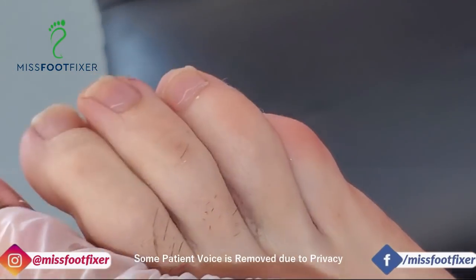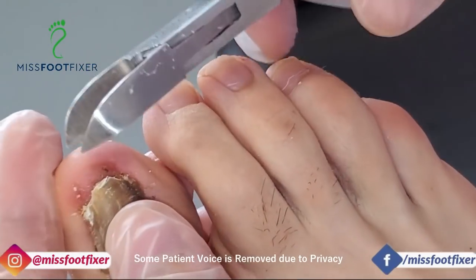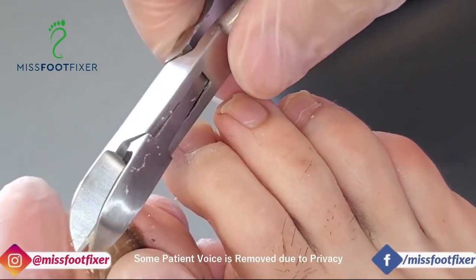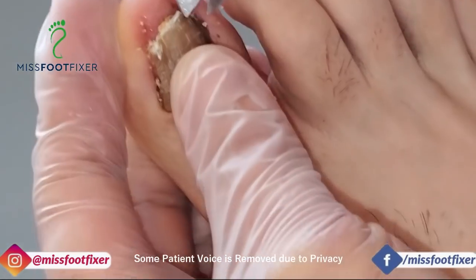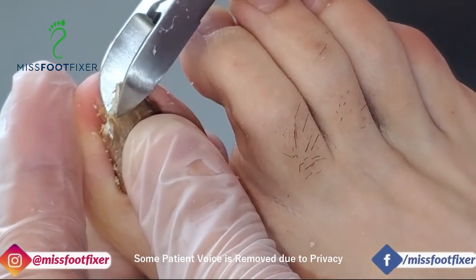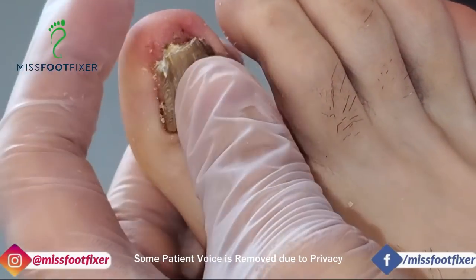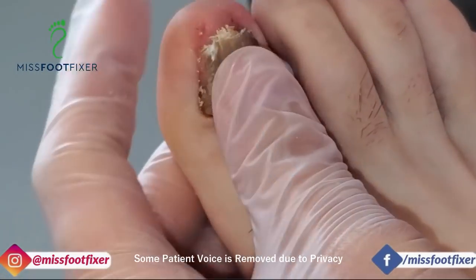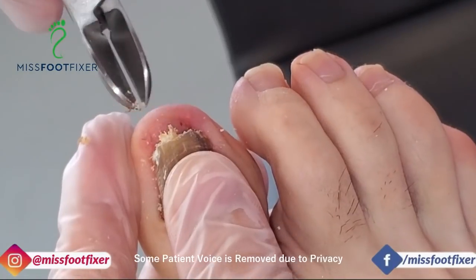You know what? I think I might start filing it in a minute. I might drill a bit more. You can drill it thinner. Yeah, that's what I think I'm going to do, just to make it a lot easier for myself. Here we go. There's a lot of debris inside. Just pinching out debris.